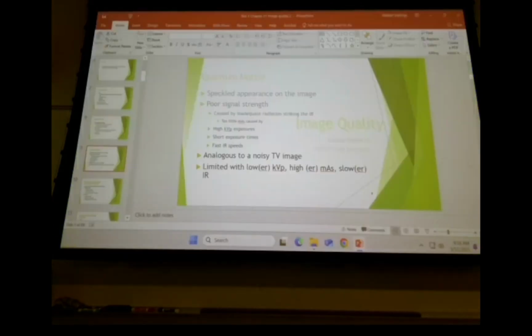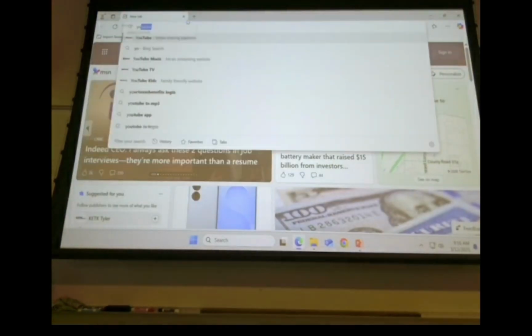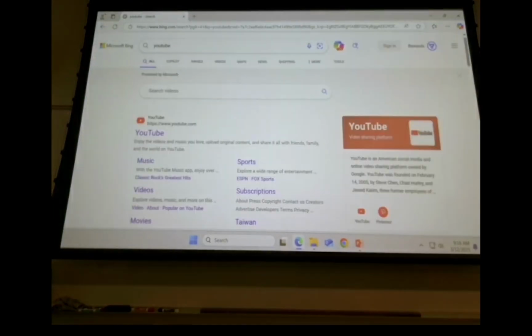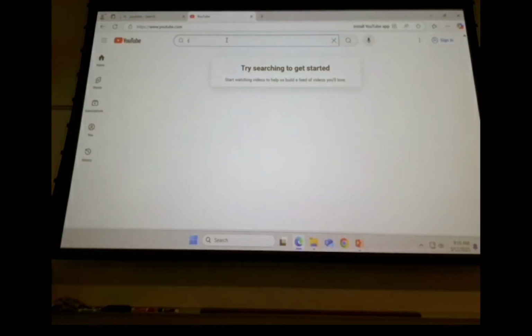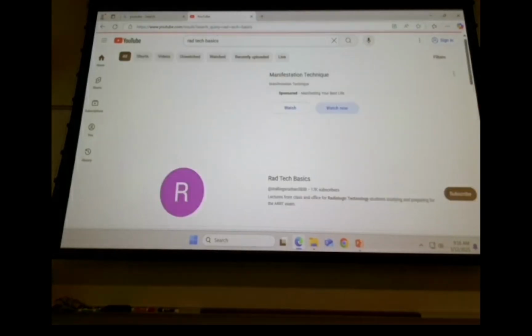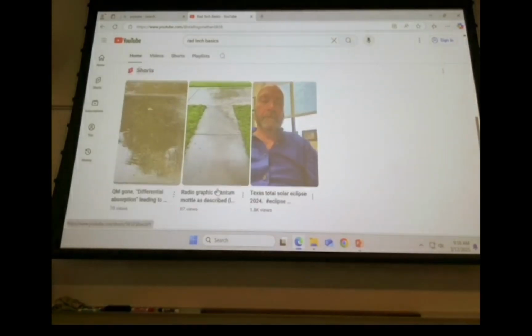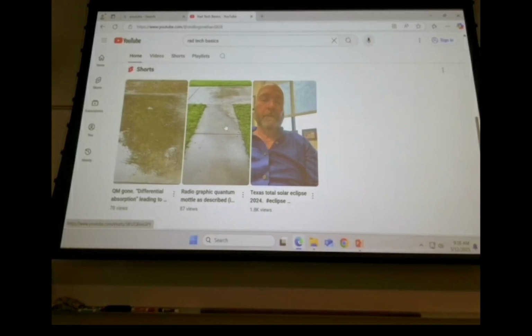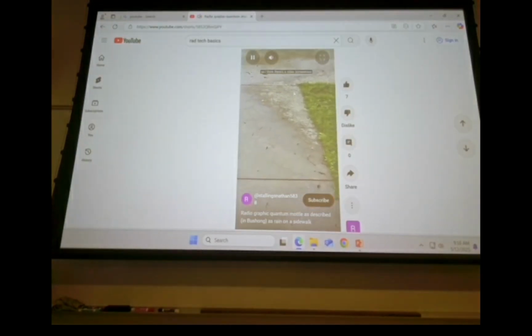Let me see if I can find this real quick. So Bushong, way back in one of the first chapters, refers to quantum mottle as being kind of analogous to watching the rain fall on a sidewalk. When it first starts sprinkling, you get that mottled looking appearance, especially out here. Okay, so that's quantum mottle.